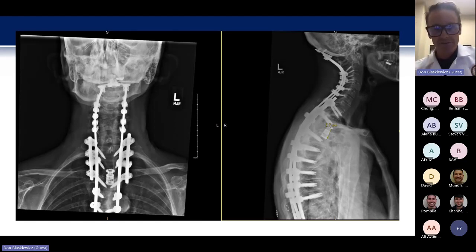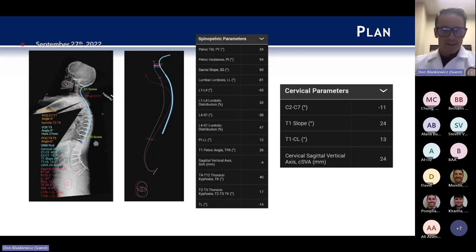So I think this was a case where, in the past, I would go the best I could with what I thought the patient would need, and I think I've had failure in the past of not getting patients lined up. Really, it's about using that rod as a guardrail of where I needed to be, and specifically understanding what her intraoperative measurement should be.